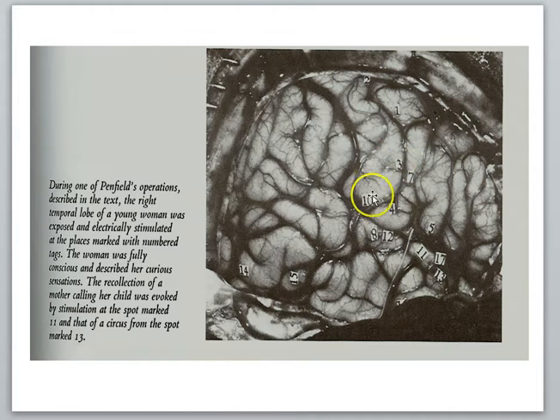But it doesn't activate region number 10. Now the idea is, because the brain cells in region 3 are going to show elevated electrical activity, they're going to signal the nearby blood vessels to increase the blood flow to this region. And the fMRI machine can detect the increased blood flow to this region. Because area 10 was not involved in the task, you don't get a signal change here. You don't get extra blood flow here.